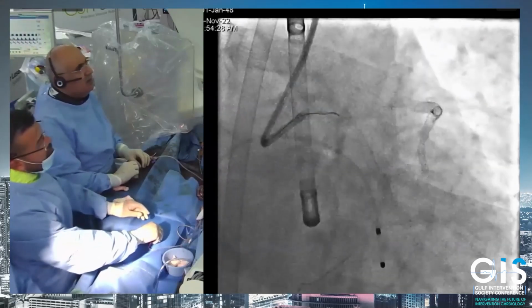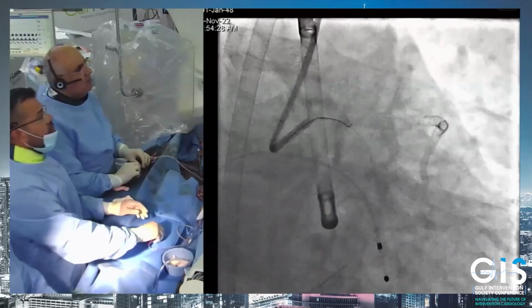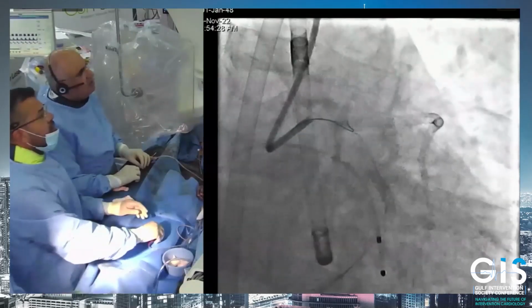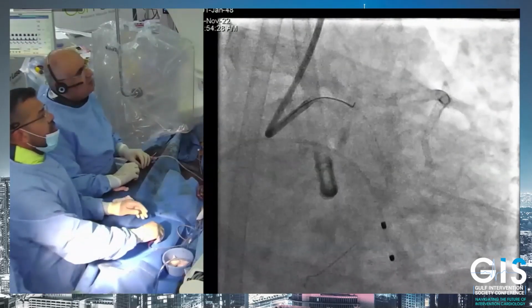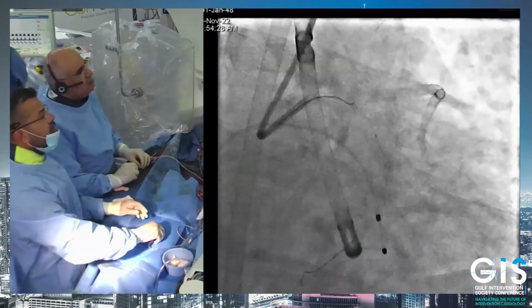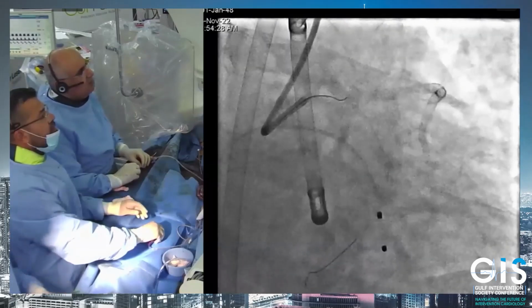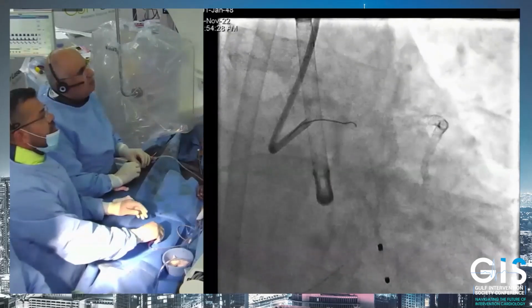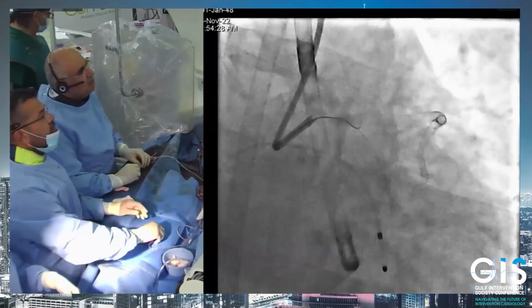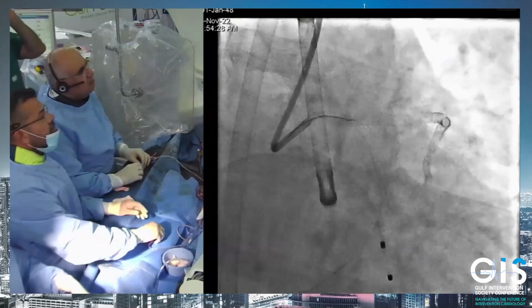It's an ostial LAD lesion, so it's a sort of left main equivalent. So finally, we will discuss the strategy for treating the left main. Starting with the CTO is the right choice. Now I will spend just a few other attempts in order to reopen this obtuse marginal, because it seems quite big. We can also discuss the best strategy to deal with this bifurcation: to start with a provisional approach like they did, or to consider an upfront two-stent strategy. But we can discuss it together.